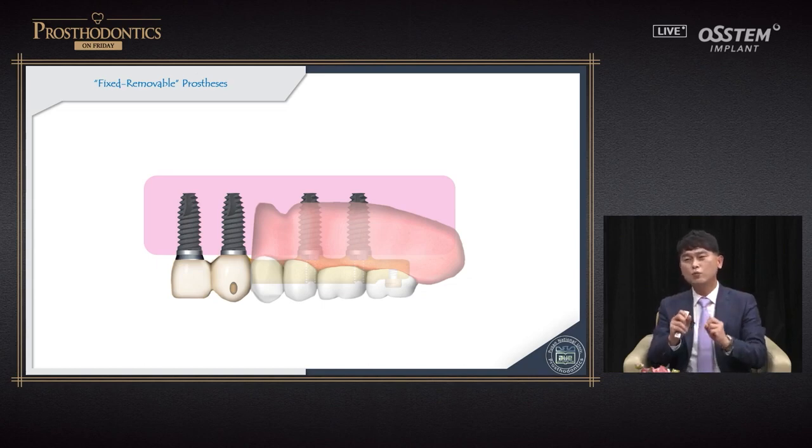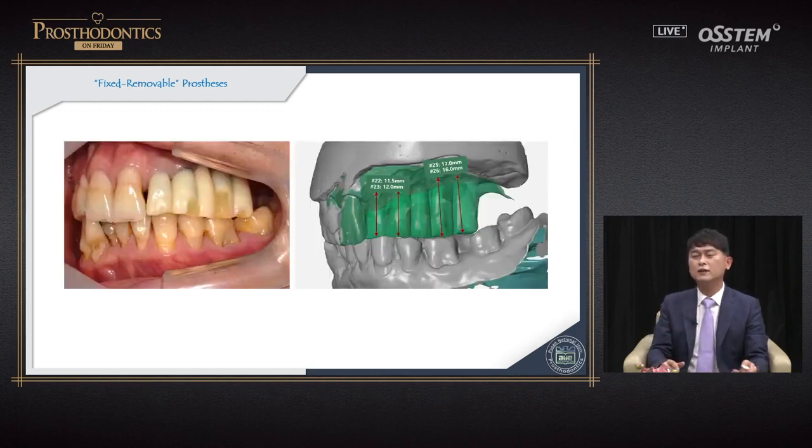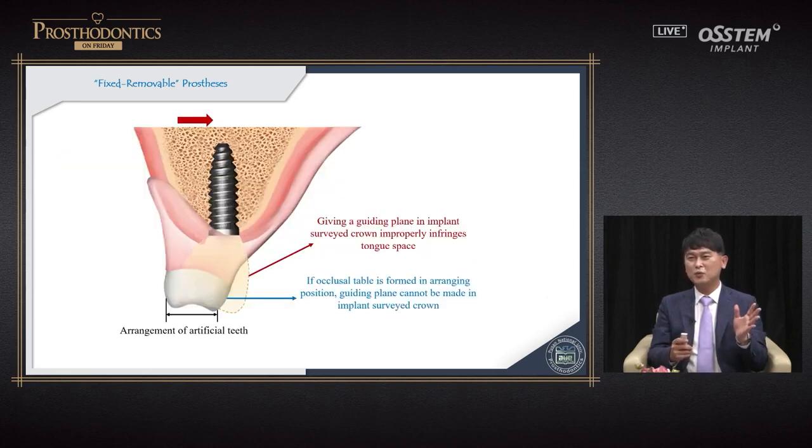The bar provides retention, support, and stability, and it's not pressing down on the gingiva. For various reasons, including aesthetics, I had to make gingiva for the patient. So we can think about using zirconia in a tiny partial area. I will explain it with some case later.